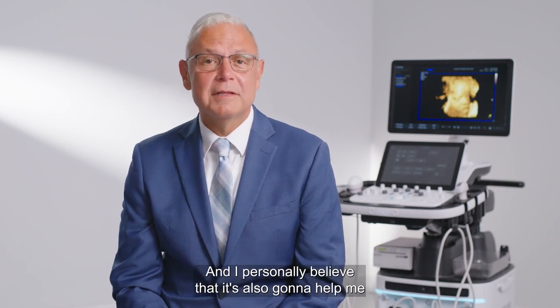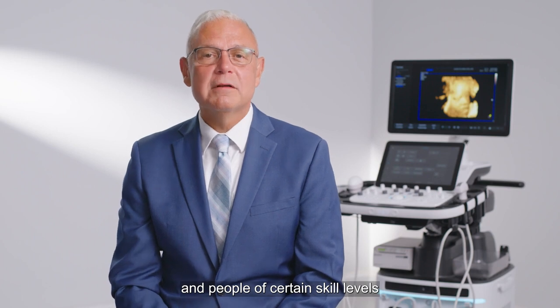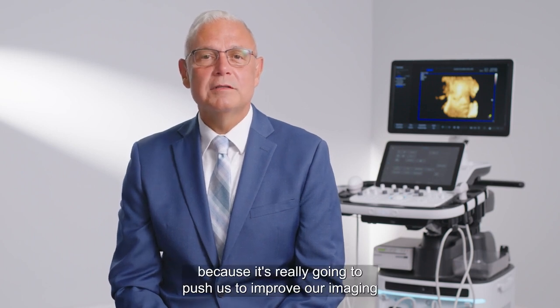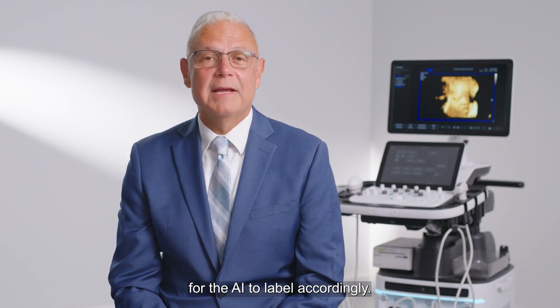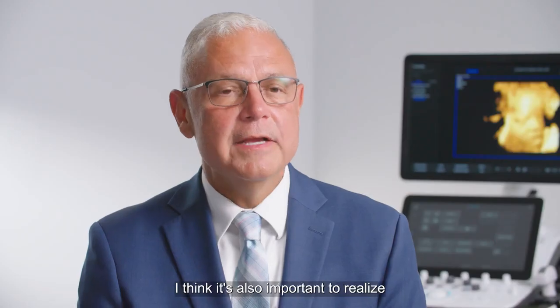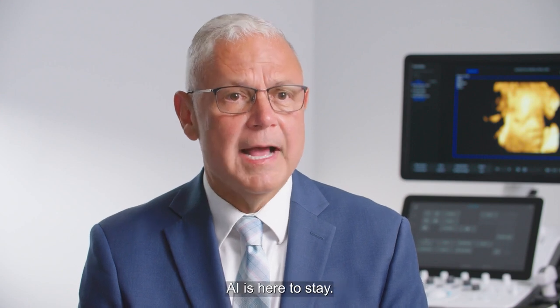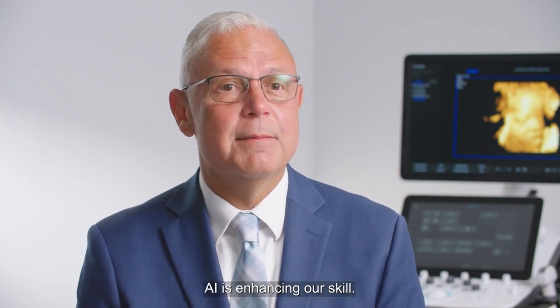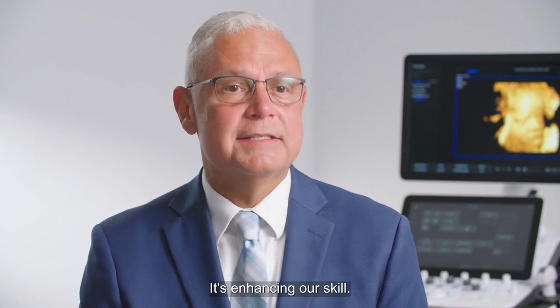And I personally believe that it's also going to help me and people of certain skill levels, because it's really going to push us to improve our imaging, to make sure that we get the best possible images for the AI to label accordingly. I think it's also important to realize that AI is all around us. AI is here to stay. AI is enhancing our skill. It's not replacing our skill, it's enhancing our skill.